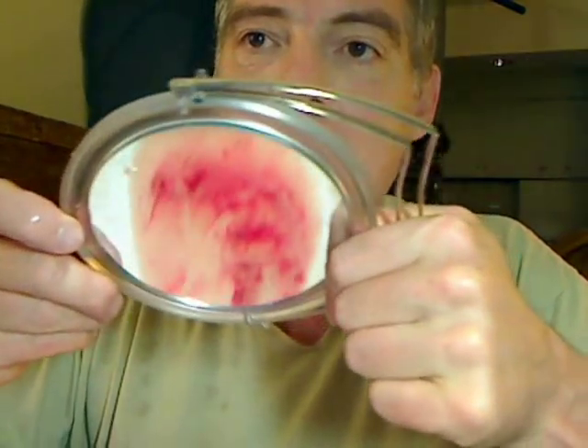Okay, so what's happening now is it's opening up. I'm going down real deep. I managed to get some things that were blocking the way to come loose. It opened up and I'm now deep, but it's not going crazy. Here's some more pieces. This is the Gracie Micro Mini 1-2 — this is a good choice. It's got good textural feel and it's very thin, so it slips in nicely. I think they're all very open.